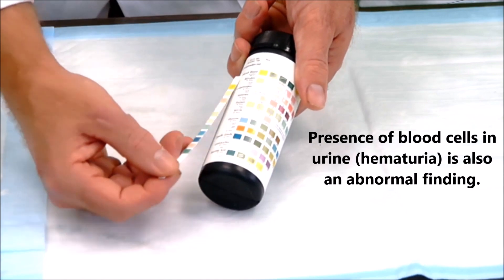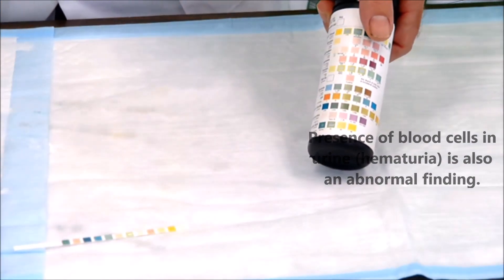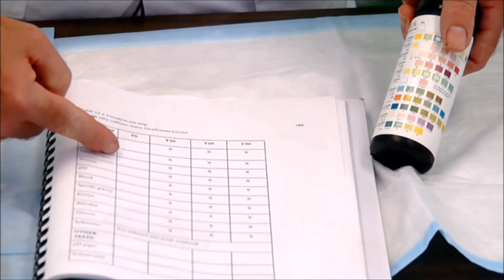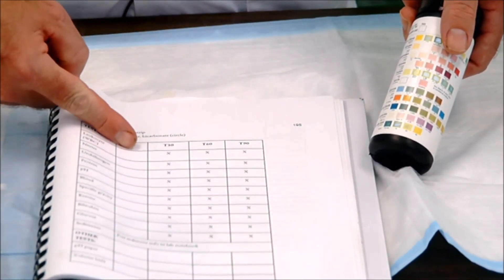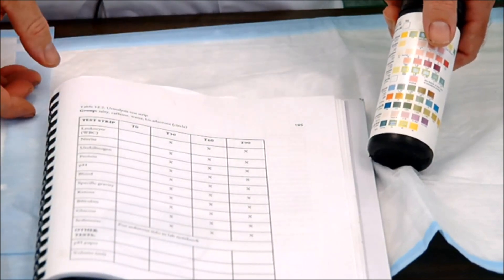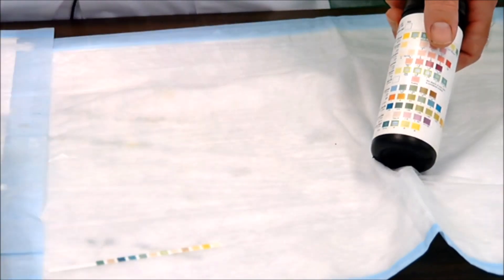So once you've done this test strip, you want to record that information in your lab manual under the time zero. So this was our time zero, and all that information goes right here. Okay, after that, you probably have another 10 or 15 minutes before it's time to pee. Once you do that, you want to do the whole process over again.